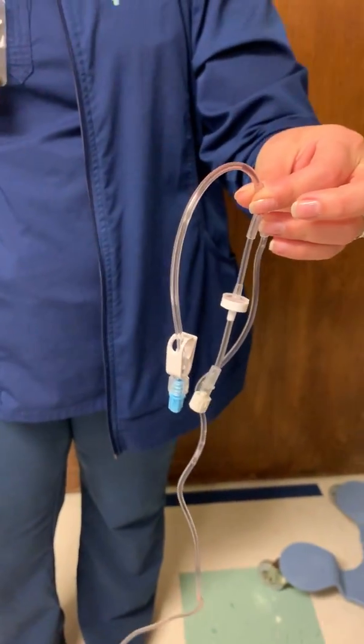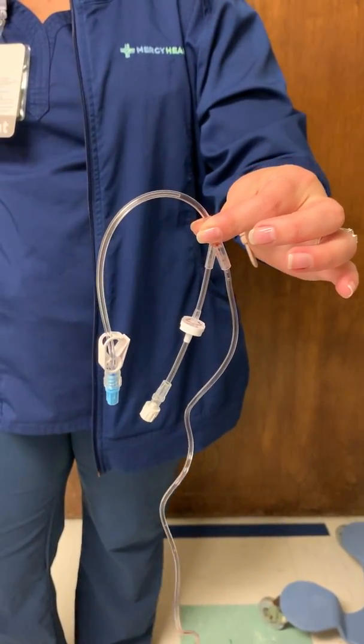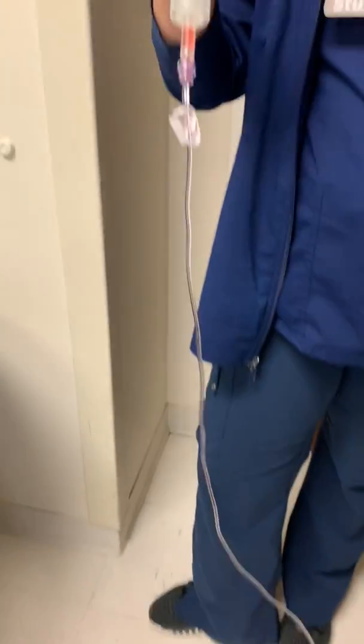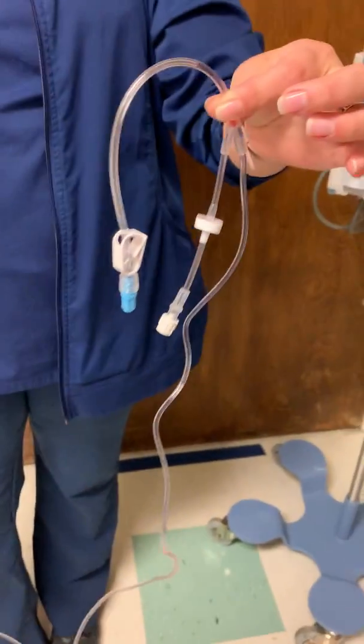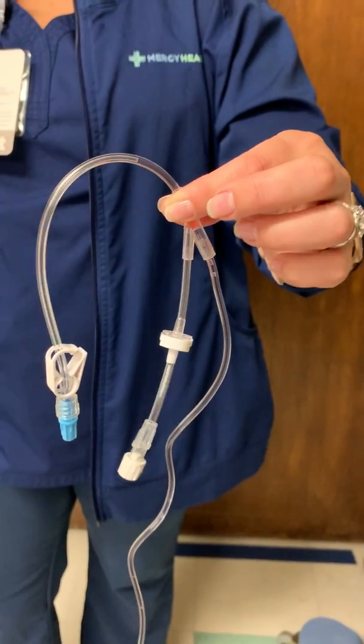Okay, very good. Now you might be thinking to yourself, we're manually priming, the pump's not going to track this amount. That's true. 2.6 cc's is required to prime the tubing, and that will not be tracked, but our pharmacy is okay with that when we record the wasting at the end of the therapy.